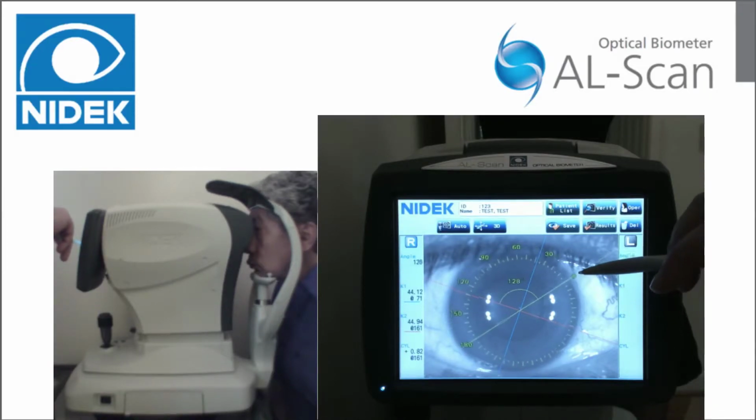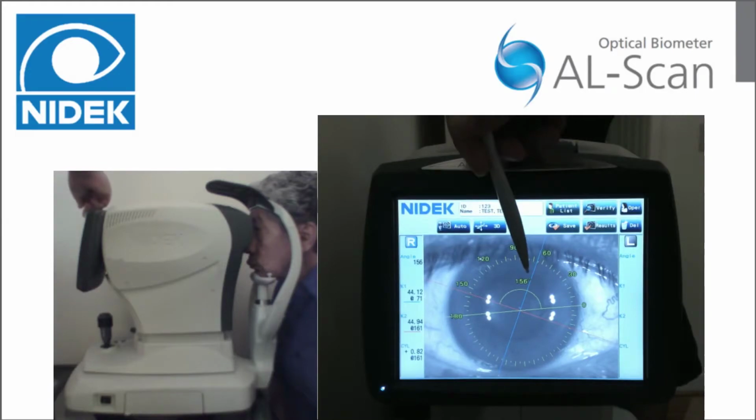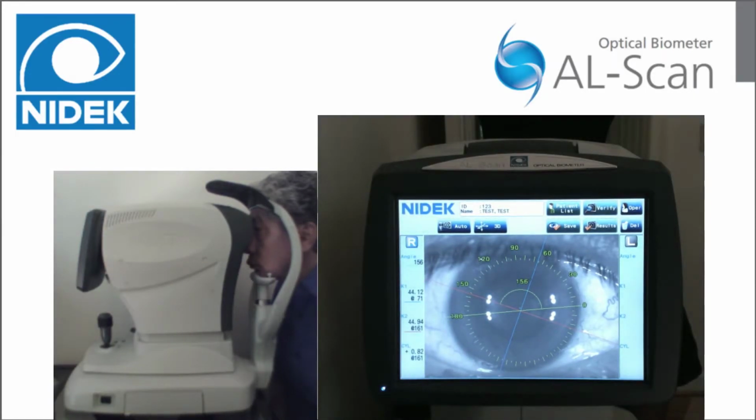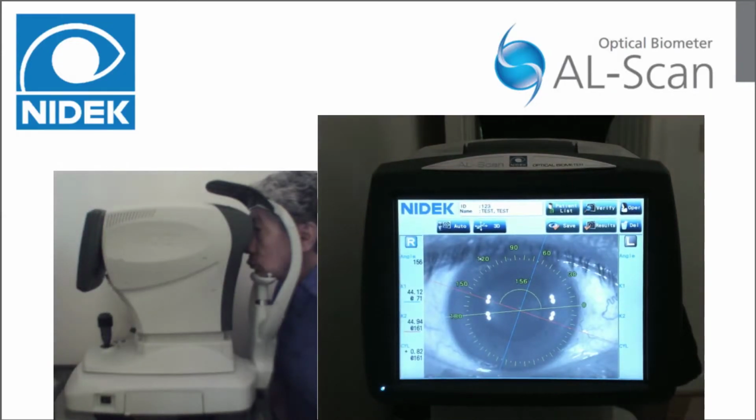The green line is the angle reference line which can be moved to the marker position by specifying a landmark. This creates an angle in relation to the steepest meridian. During surgery, implant the IOL so that the angle of this marker and the toric lens axis mark is the same as the angle obtained in the Toric Lens Assist Mode screen.